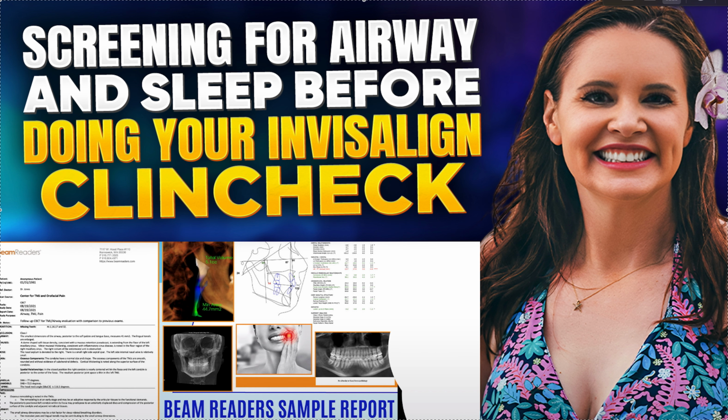Okay, next, adults. This is where sometimes, if people work with me on a case, they can get a little frustrated because I'll say, wait, we can't just do all that. A lot of times in adults, things are more limited. We can't just necessarily expand. Yeah, there's surgical ways of expanding. And yeah, if you're putting in an appliance, that widens things. You really need to run this either by perio or take a CBCT, and integrate it in the plan, because the bone is not going to necessarily move with the teeth in the adult.